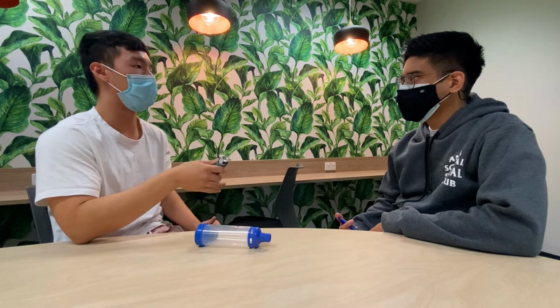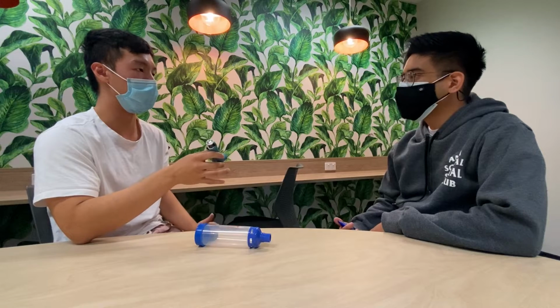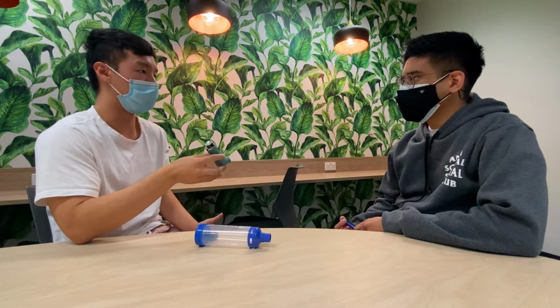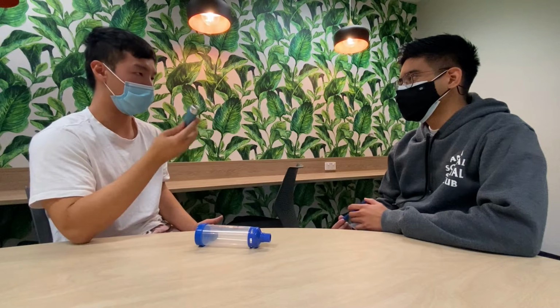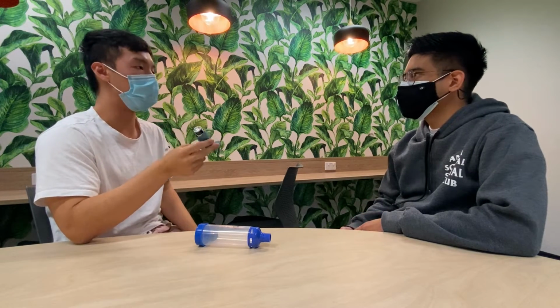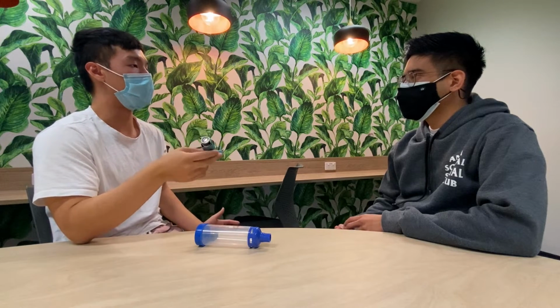If that's the case, it might be worth going to your GP and arranging changes in doses. But just to let you know, that's quite a common side effect of a Ventolin sort of inhaler. Now the preventer, which looks similar but might be a different color, perhaps orange, that's a preventer medication. So we would use that regularly every day. That prevents asthma attacks from coming on.